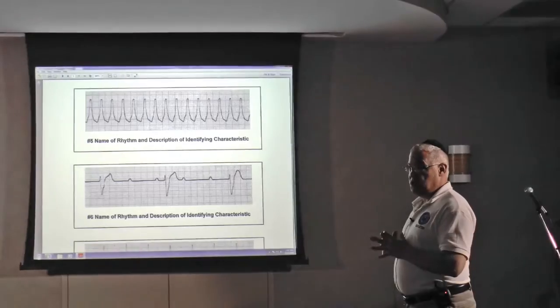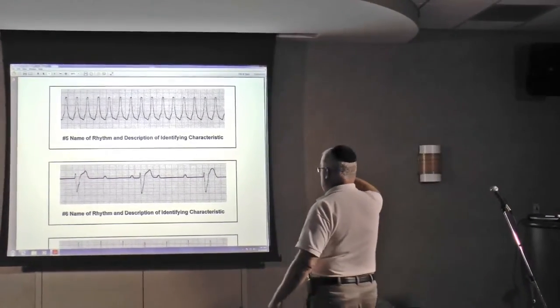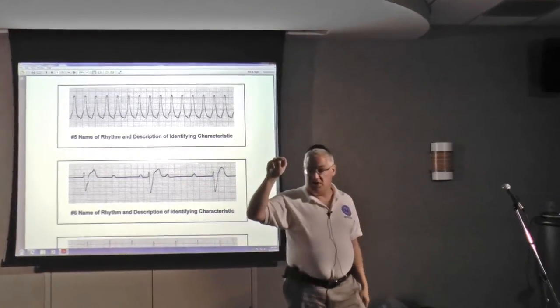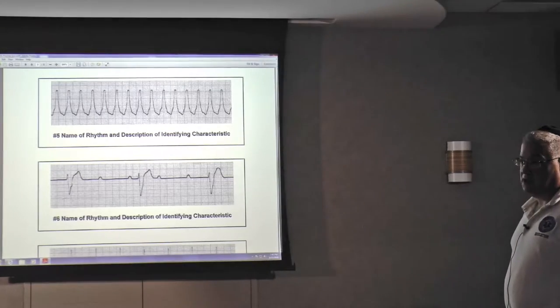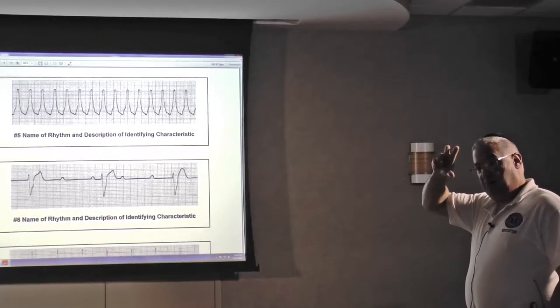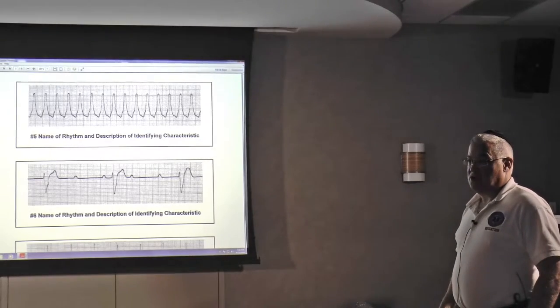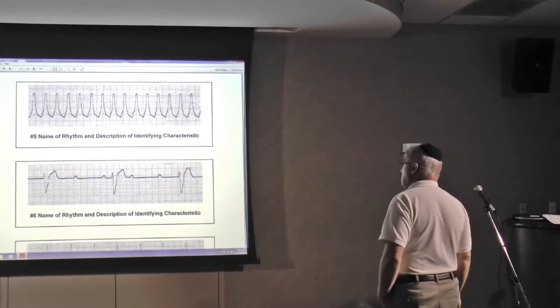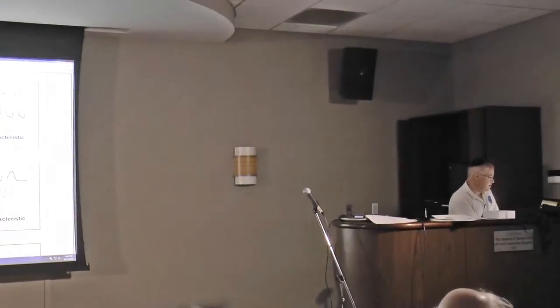If he was really unstable and you put it into the cardioversion mode, the word sync comes up on the screen. And on the top of every QRS, it'll put a little symbol. Sometimes it's a heart, sometimes a triangle. That's telling you the machine is actually syncing and knows what it's looking at. With the older machines, sometimes they have problems syncing. So you could always turn up the gain, which makes the complex look a little bigger, and that would help it find it. Or if you had downward facing QRSs, like you do over here in number six, you could flip to a different lead where you'd have upward facing ones and it would be easier. But the new machines are pretty good with that. So number five, we're going to call VTAC. Again, if the patient was unconscious and you put the AED on them, the machine technically would shock them if the rate is over 150, and it does look like the rate is over 150 here.